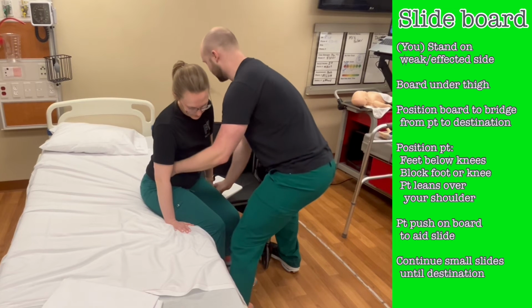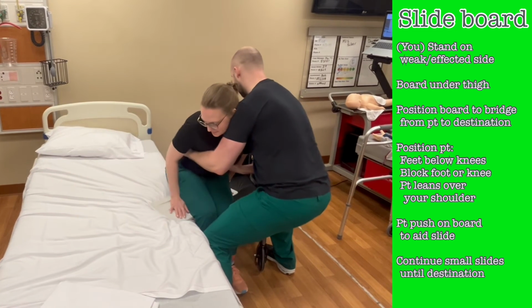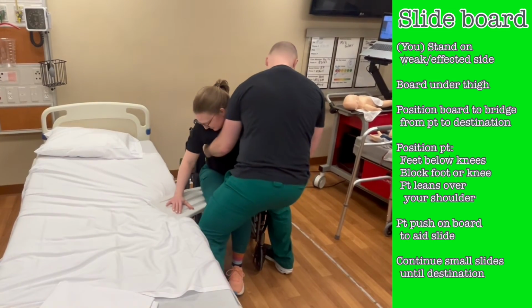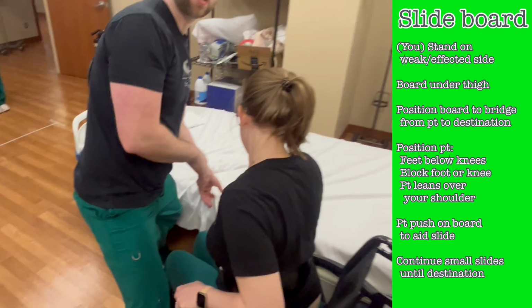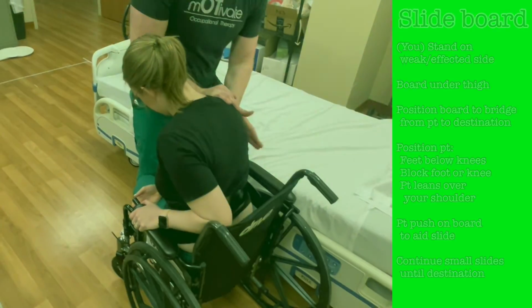Take as many scoots or slides as you need, and once the patient is close enough to the handrail that she can reach it, have her hold the handrail with her strong hand. Perform another slide to get fully onto the seat. Then have the patient lean slightly so you can remove the slide board and lock the armrest back into position.